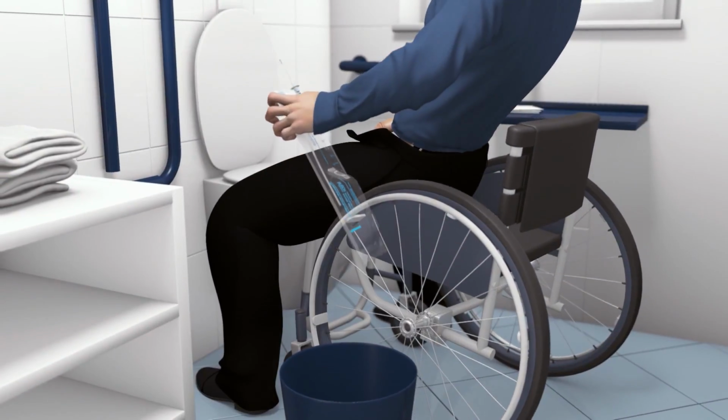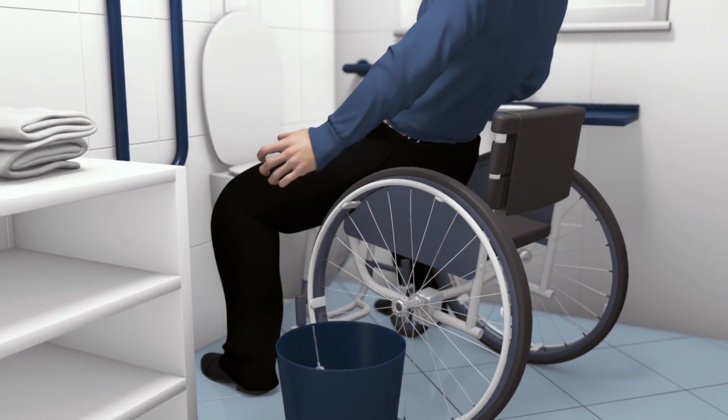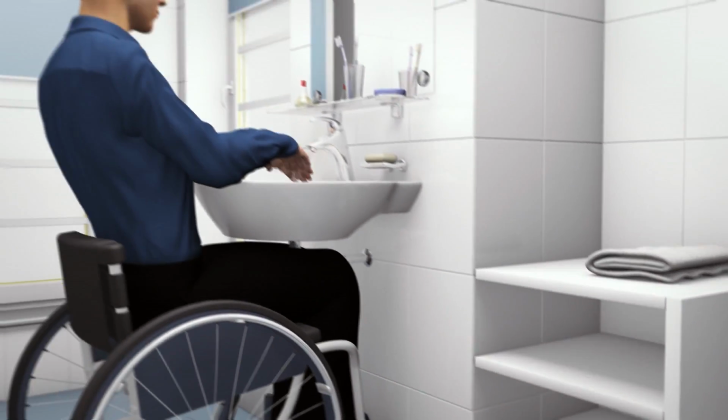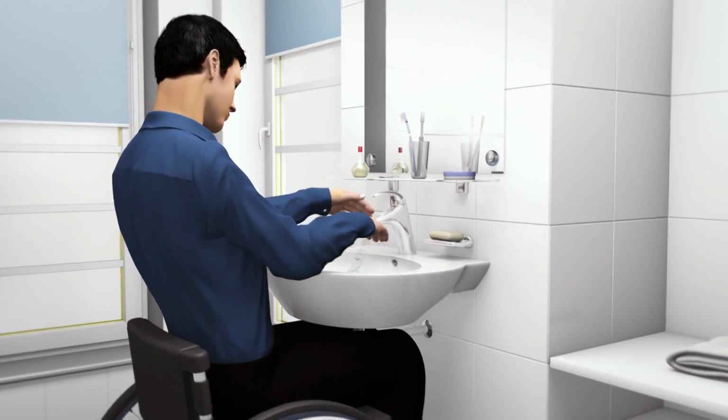Pour the urine into the toilet. Dispose of in a proper trash receptacle. Finally, wash your hands again.